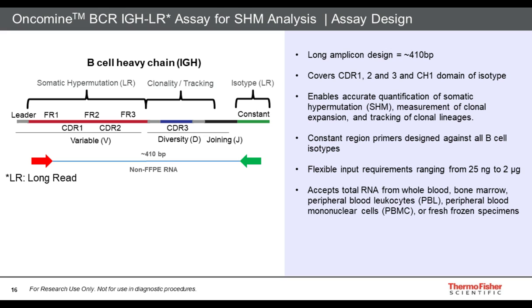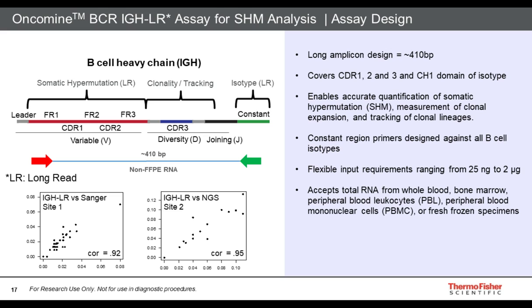And as part of the development of this assay, we have compared the somatic hypermutation data from this assay with orthogonal approaches such as Sanger sequencing or NGS. And there's a very strong correlation as one might expect.